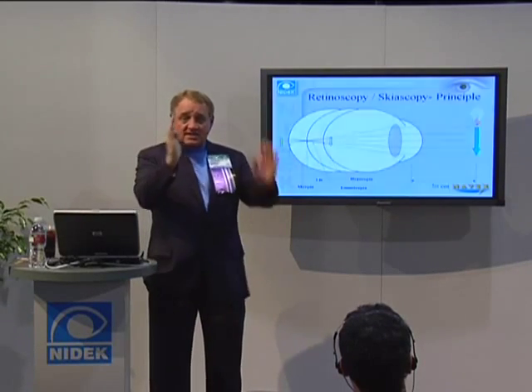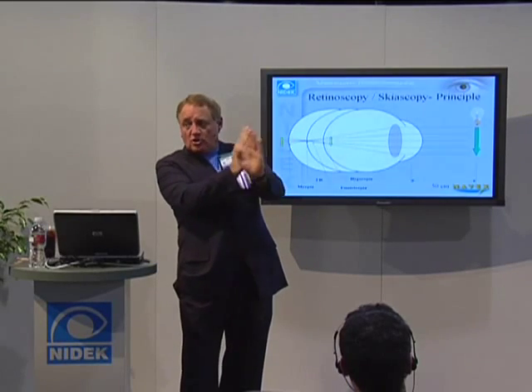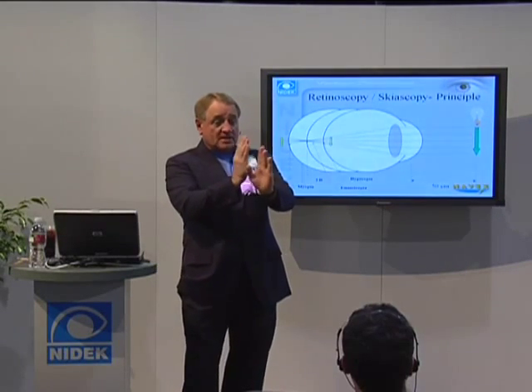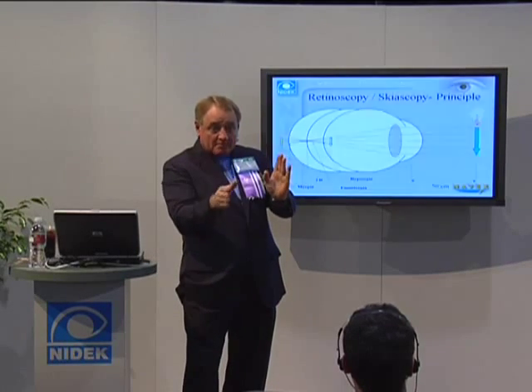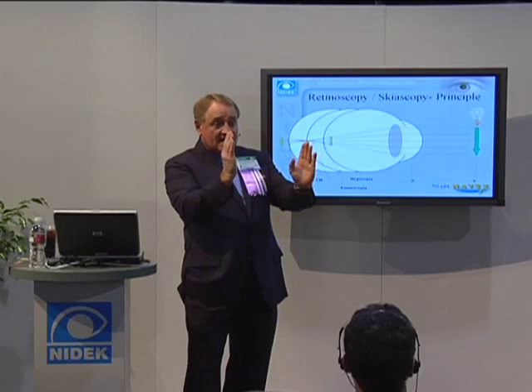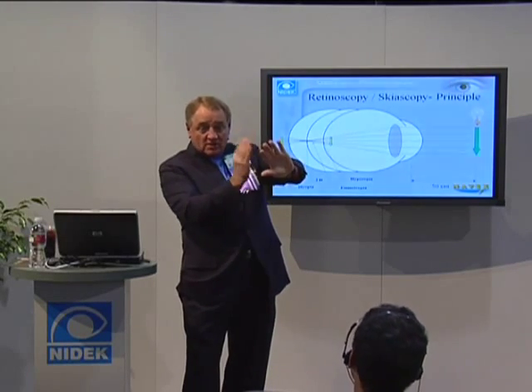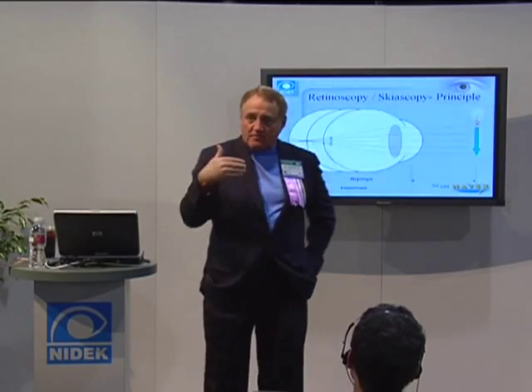If you move the slit this way and the retinal image or the pupillary image goes this way, you know there's too much power in the system. So you add minus when you're refracting a patient, right? If the image and the slit move together, you know the patient doesn't have enough power, so you start adding plus. And when it gets to where it doesn't move and the whole eye is filled, you know you're at neutral, and that's the refractive error of the patient.